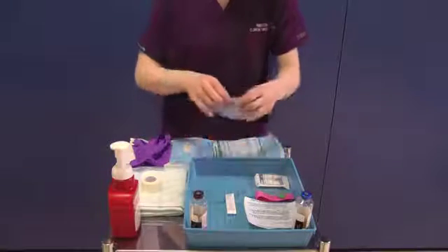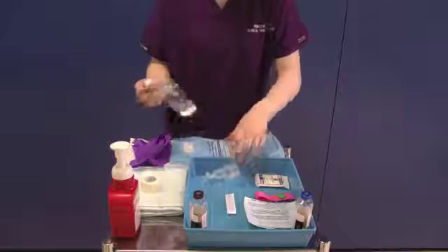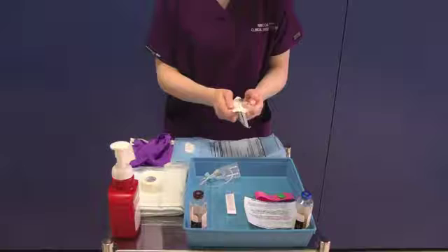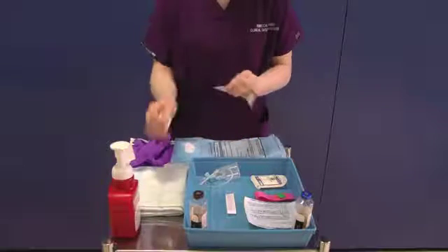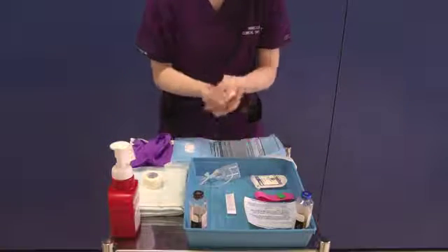Open the collection set, ensuring the key parts are still protected. Partially open the sterile gauze and remove a strip of tape in preparation for use later. Decontaminate your hands and apply an apron and non-sterile gloves.